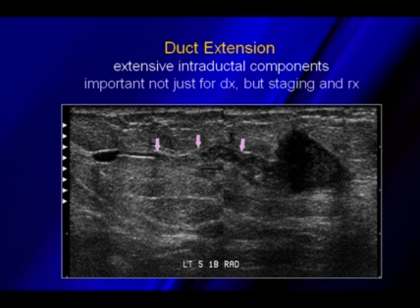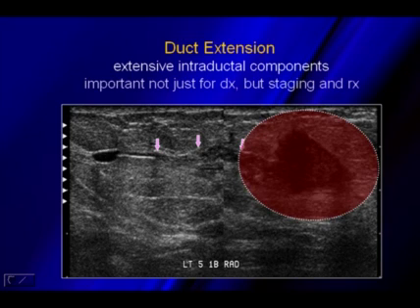If you look in a fairly large breast center and you have never seen duct extension like this, it may be because you're imaging more in a transverse and longitudinal scan plane, but it's very important to make sure that you do see duct extension. If you've ever been into the operating room, one thing that you'll notice is when they go in and do a lumpectomy on a patient like this, they'll make sure that when they remove the tissue, they have at least a 1 centimeter clear margin all the way around the lesion.